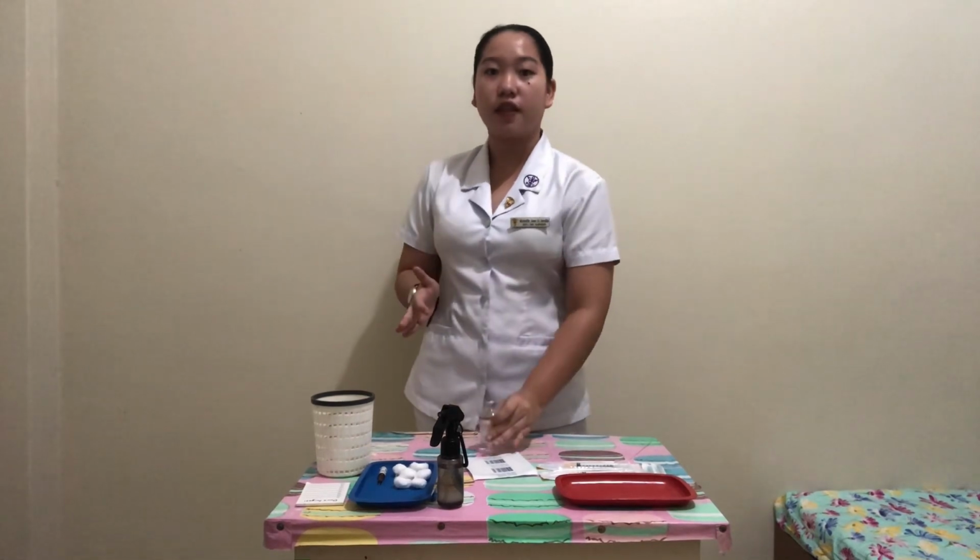And now for the drug withdrawal, first mix the solution by rotating the vial between the palms of the hands, not by shaking. This is because some vials contain aqueous suspensions which settle when they stand. And in some instances, shaking is contraindicated because it may cause the mixture to foam.